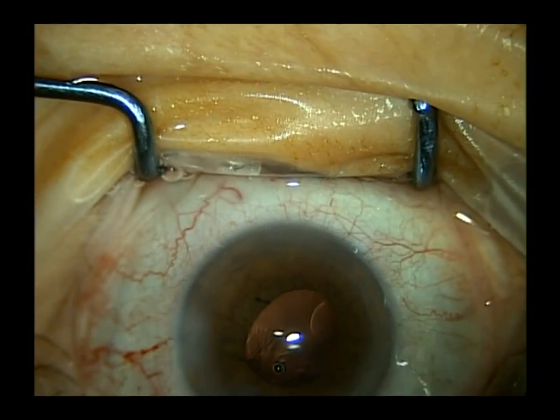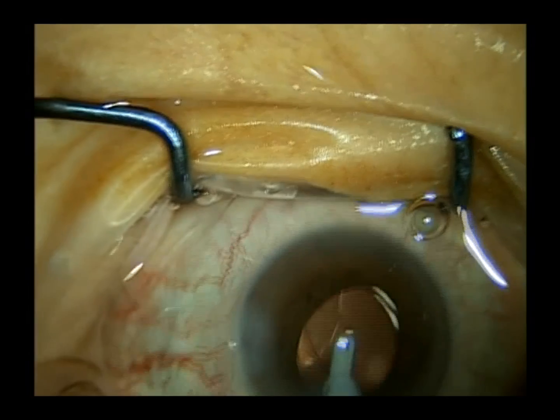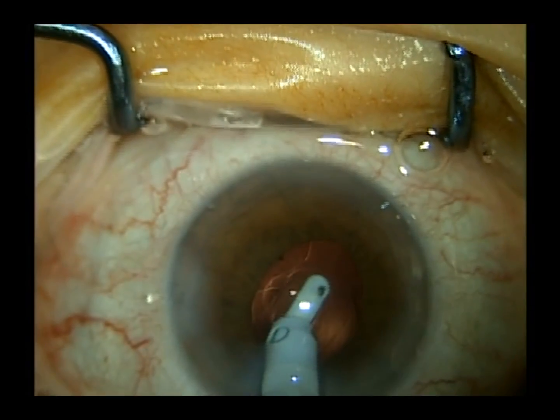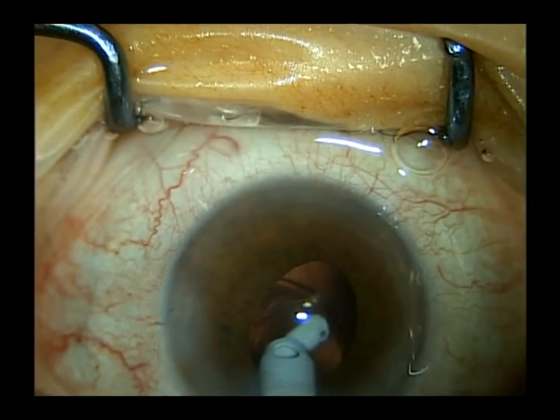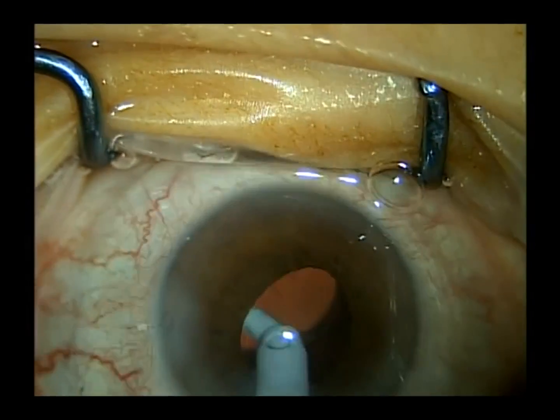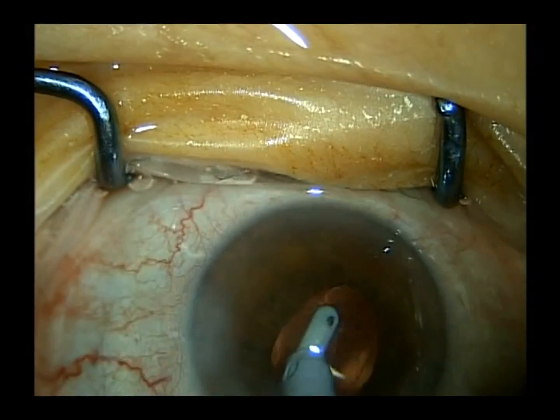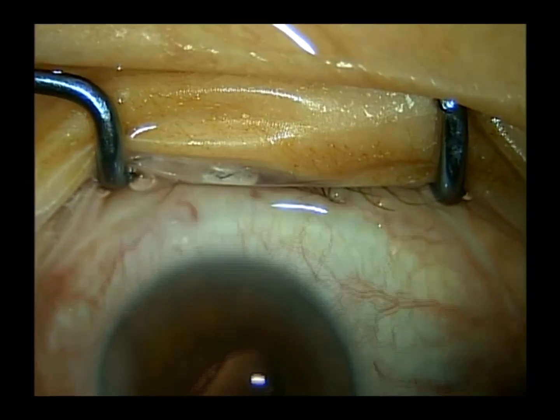So then we go ahead and firm up the globe, hydrating the paracentesis port. We remove the remaining viscoelastic, and we have another happy customer who's had a nice, safe cataract surgical procedure. Most of my cases, I'll spin the lens in the bag to bring out any residual cortical fragments.